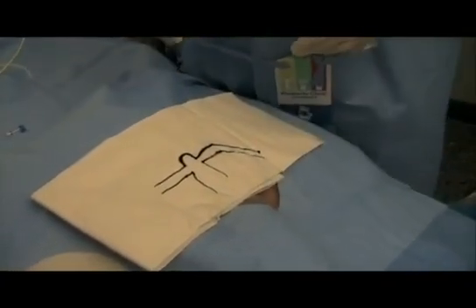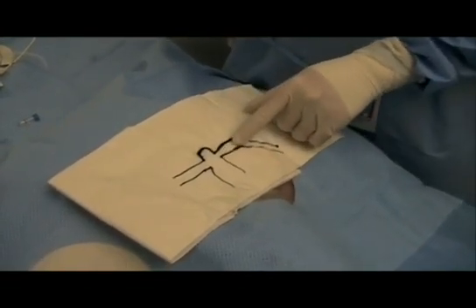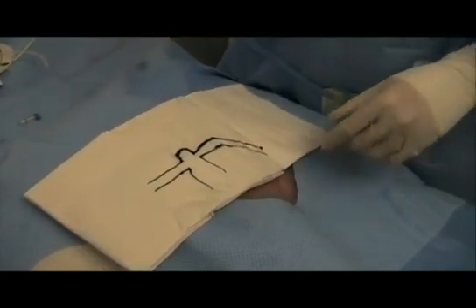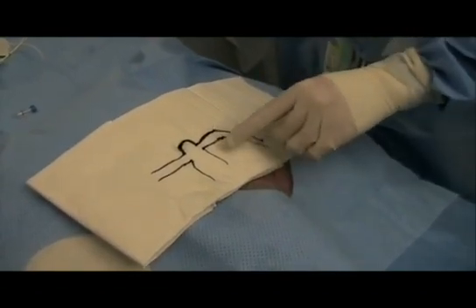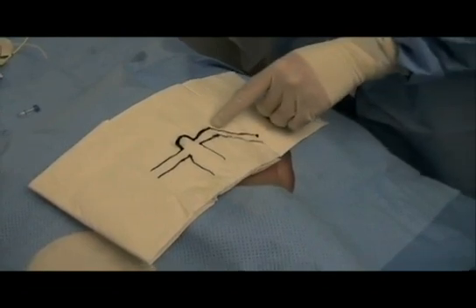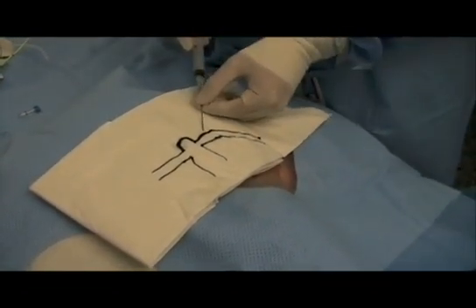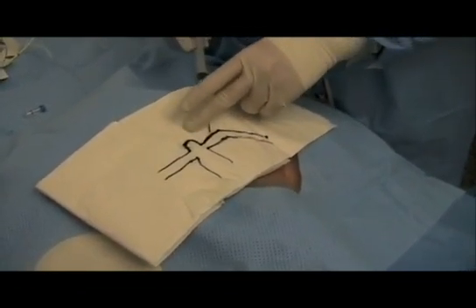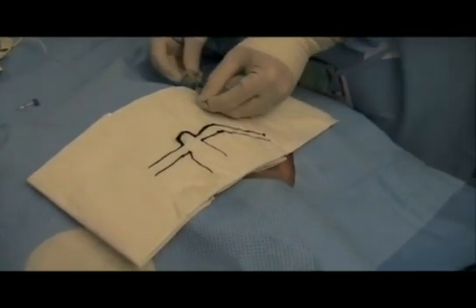Here we have a rough representation of the patient's anatomy. You have your sternal notch, you have your clavicle — the clavicle goes straight for a portion and then it sweeps back towards the patient's shoulder. I'll find where it transitions from that straight portion to that diagonal portion, and that's actually where I'm going to go underneath the clavicle. If you try to come in more medial, there's so much muscle where the pectoralis attaches that it's really tough to get underneath the bone.